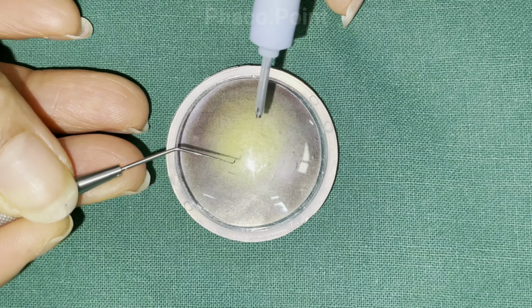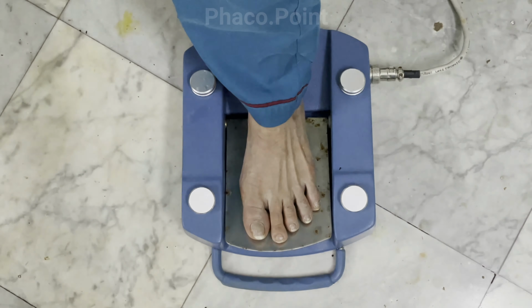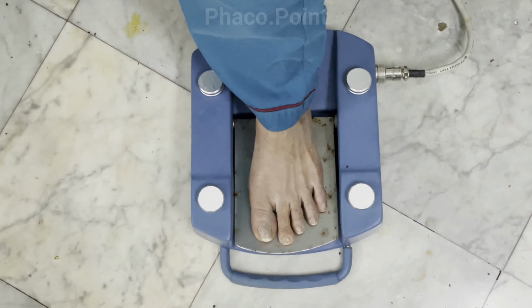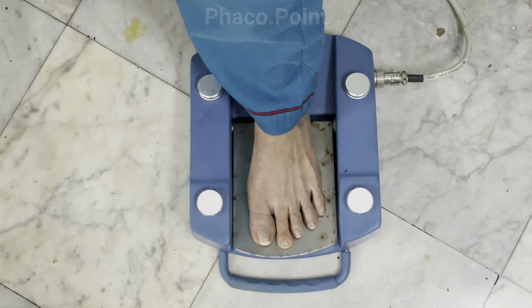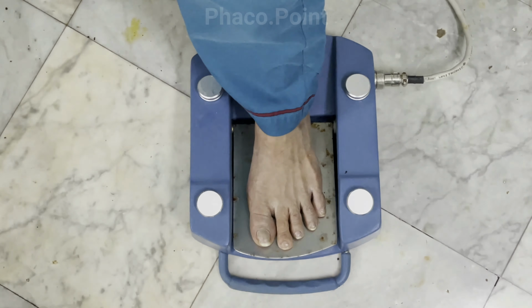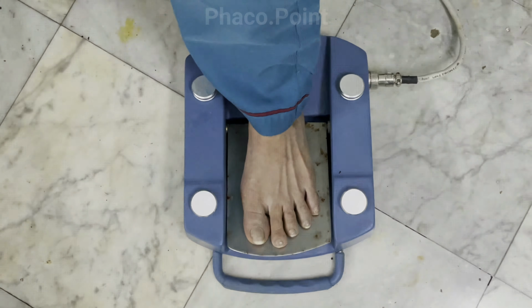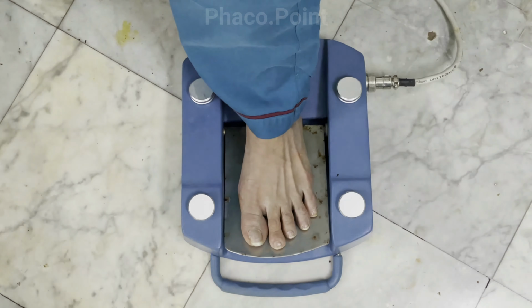Let's now understand the foot pedal control for performing the direct chop. Before entering the eye, we move to foot pedal 1, that is the irrigation. Now we've done all the same steps, that is turn the bevel up, get your second instrument in the eye. Then we move to foot pedal 2, which is aspiration, and clear all the cortex which might be blocking our view of the anterior nuclear surface. We move back to foot pedal 1, and now we are ready to perform the direct chop.